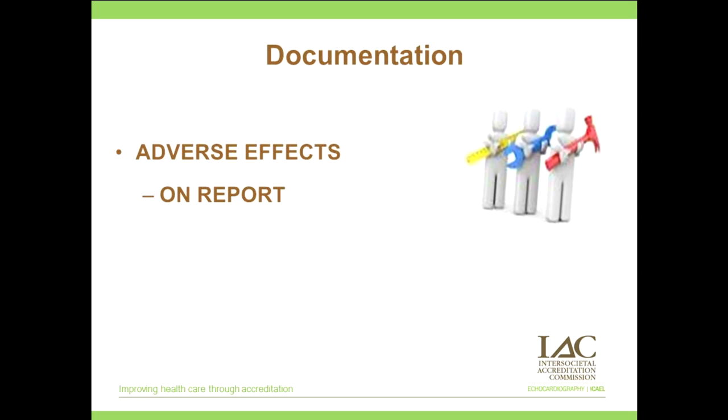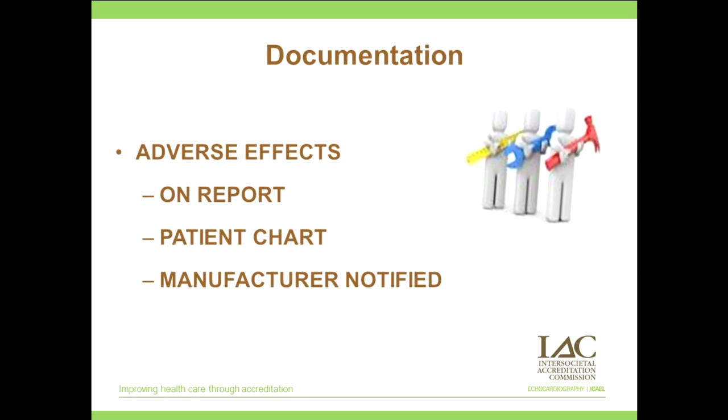Of course, we know the report has to have documentation regarding the use of contrast, that contrast was used. But it can also include documentation on the adverse effect. Another place for documentation is, of course, the patient chart. And a side note, the manufacturers always like to be notified when a reaction occurs.